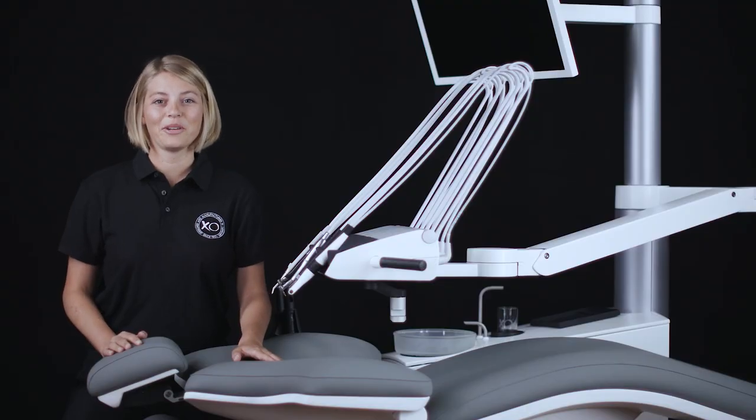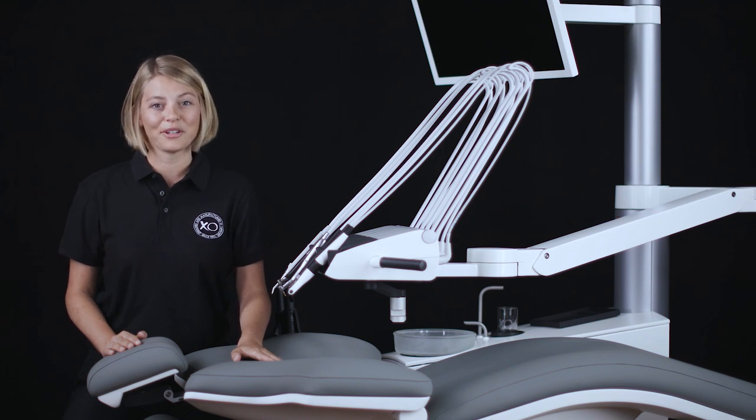In this video tutorial you will learn about the correct and efficient way to clean and disinfect the upholstery of your XO unit. This procedure applies to both XO Comfort and Sky Upholstery.